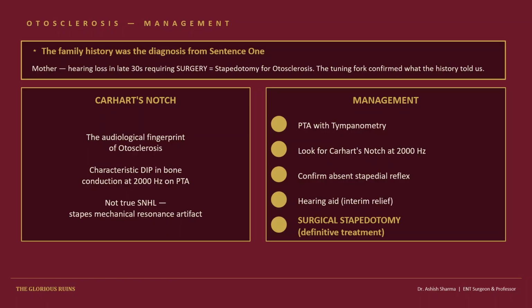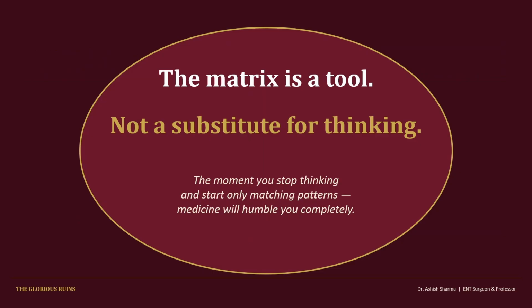Patient 3, the curveball, caught because we were thinking, not memorizing. 3 patients, 3 completely different tuning fork profiles. 3 diagnoses: a school teacher with fluid in her middle ear after a cold which she had recently, a factory worker with noise damaged nerves and a red flag that needed an MRI, and a young woman whose tuning fork results defied the textbook until you understood the acoustics behind them.